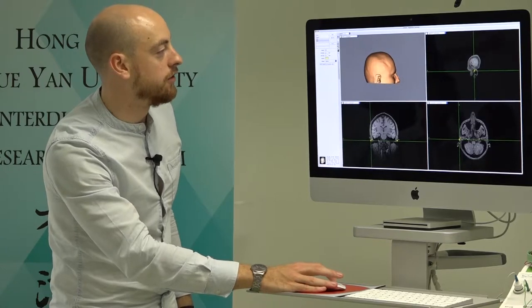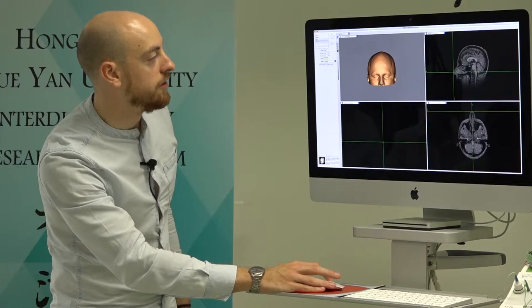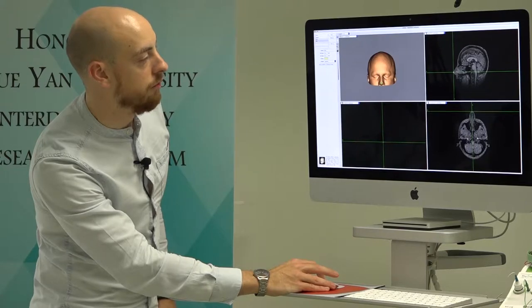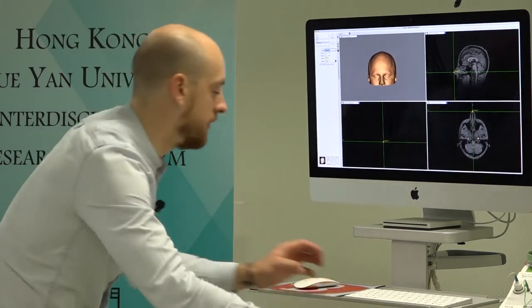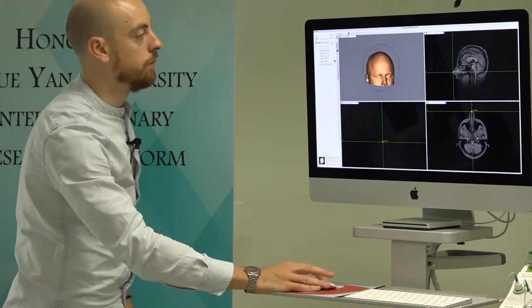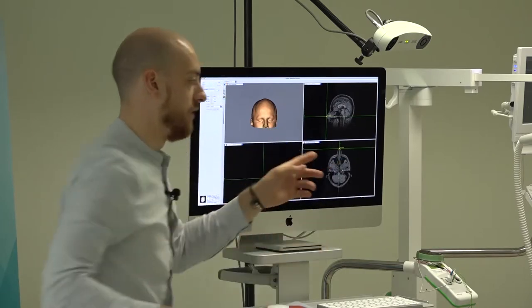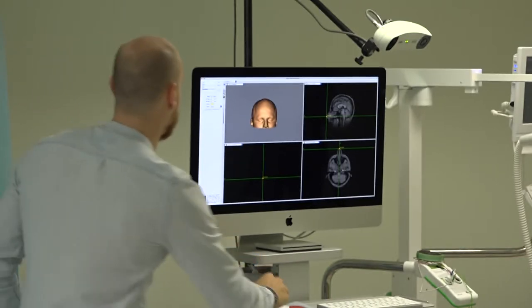on the tip of the nose there, so we want to swing our subject round, find the tip of the nose. Again, make sure you're being nice and accurate with this. So double check in the sagittal plane that you are right on the tip of the nose. And then new one there, we can set that as tip of nose. Okay, cool. So that's our landmark setup. So that means now, when we have a subject sat underneath the camera, those landmarks are going to be identified on the subject. So with the coil nose, where it is in relation to those points.